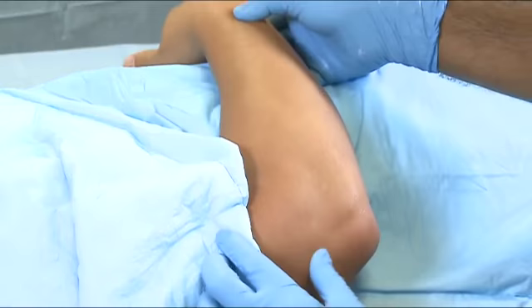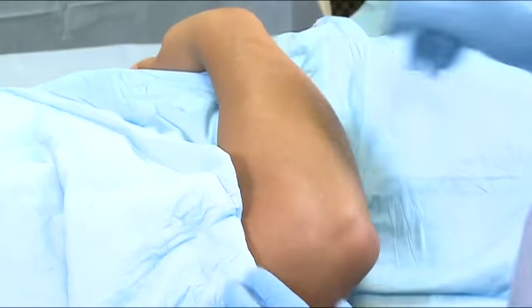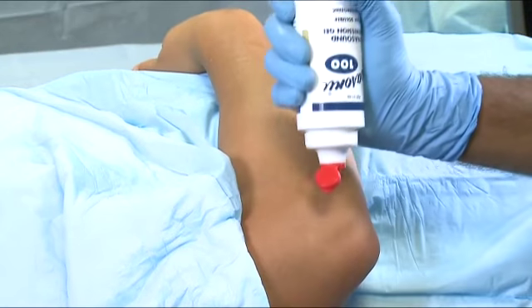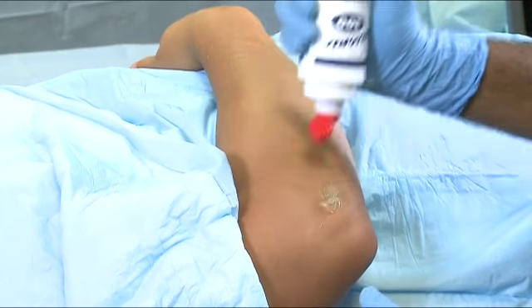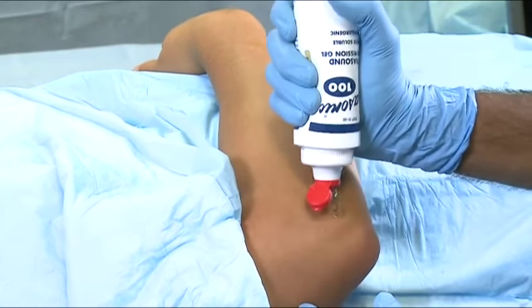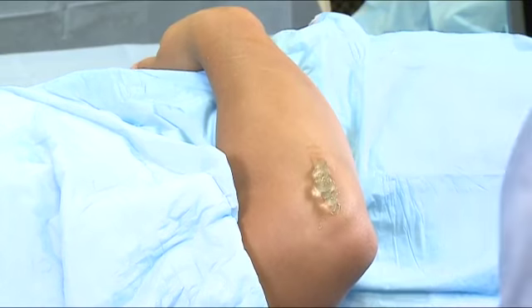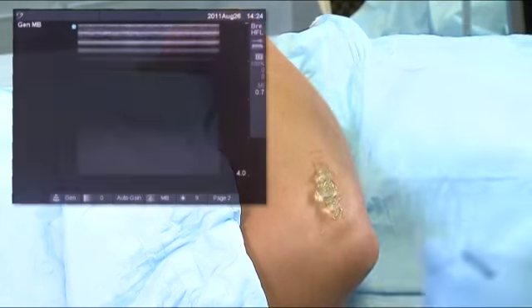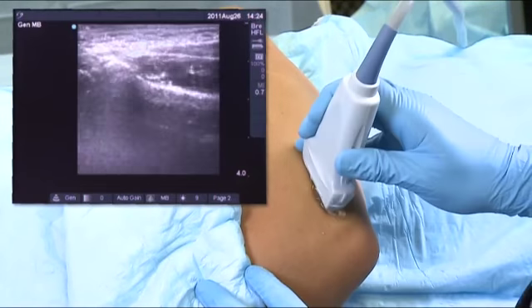I'm just going to move your elbow in a little bit. We're going to put a little ultrasound gel and take a look at the disease that we think is there in your tendon.